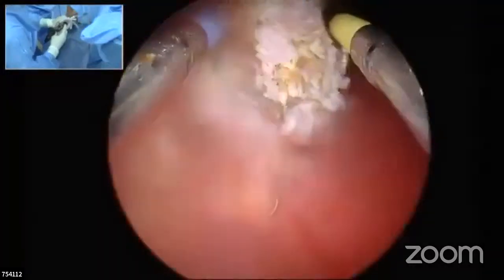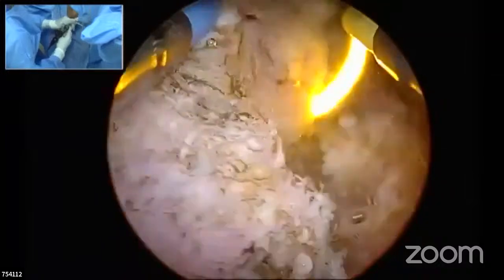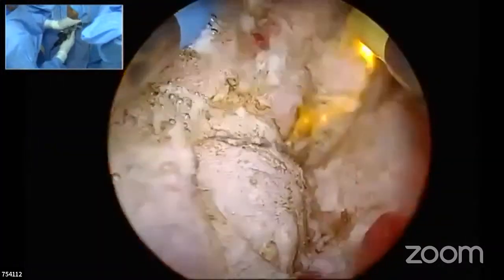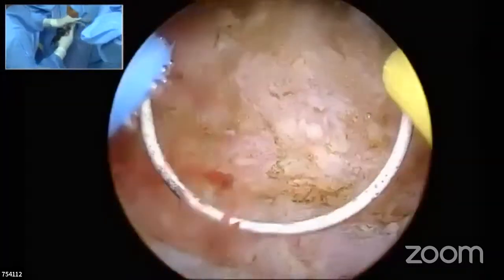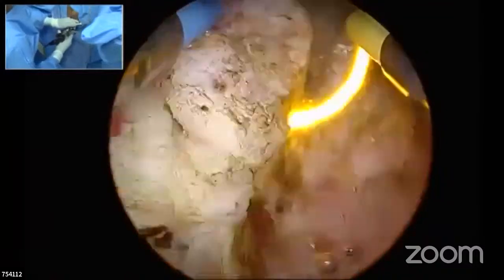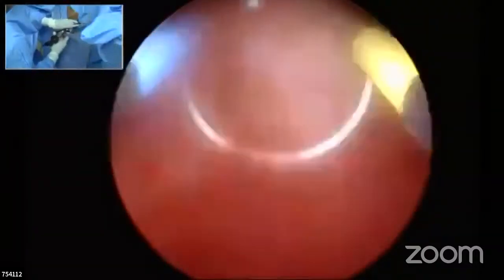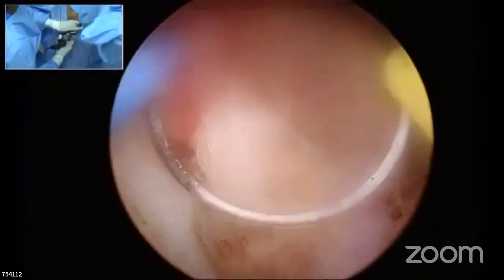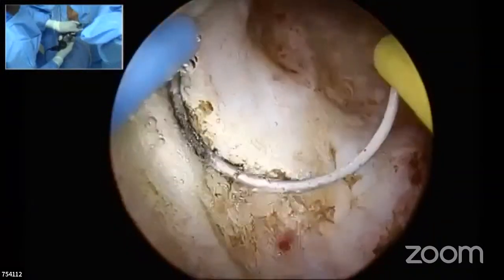Wherever you think you are going to have a problem, meaning there may be a vessel inside in the depth, you make a small, superficial cut. Otherwise, when you think there's a large gland, you can make a deep cut. That is the way I manage. Absolutely, sir. And I'm talking about people who are learning. That's a better way so that they have control over it. That's what I'm saying, sir.